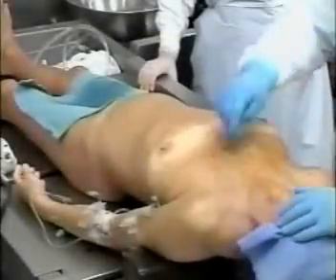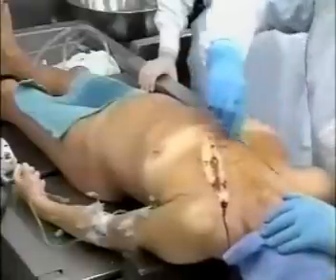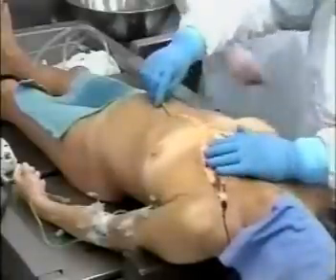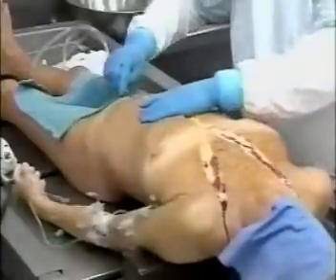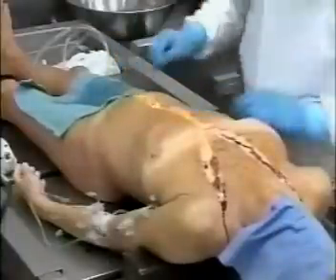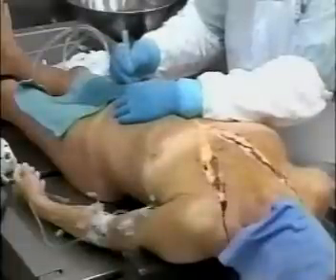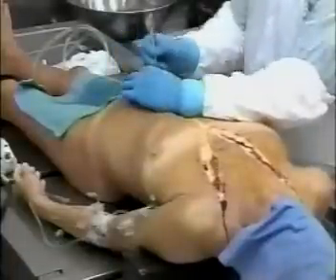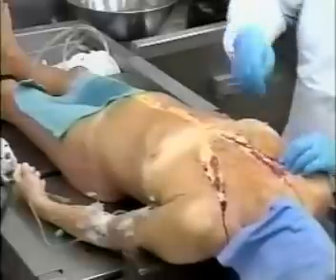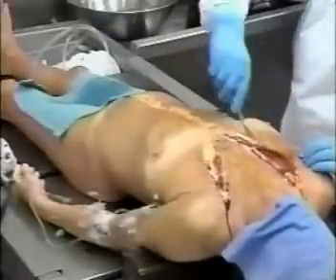The assistant is going to make the first incision. In any autopsy, the classical way of beginning is by making a Y-shaped incision, starting on the chest and then extending downwards to the pubic area. This allows full exposure of the various body cavities while still maintaining a procedure which allows for an open casket funeral, if that's what the family desires.